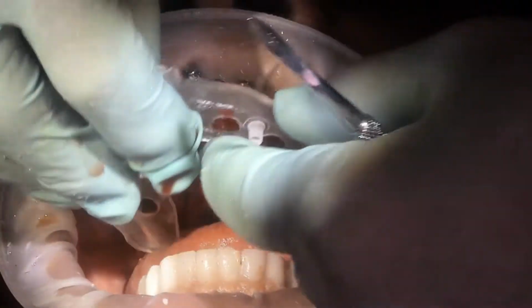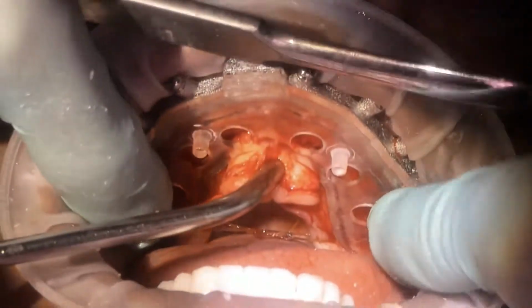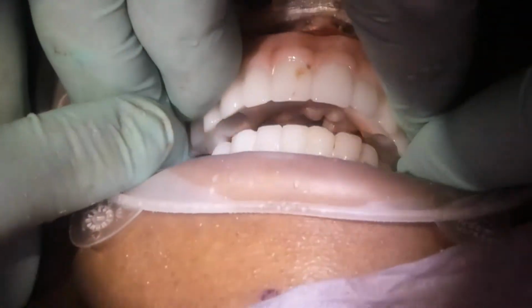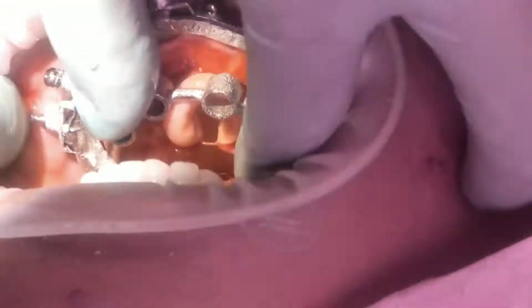Then this is a helpful trick that most of our Chrome users use, which is to place the carrier guide and make sure that it seats and clips in gingerly. If it does, then you can place the prosthetic on and check occlusion in a single arch case. In a double arch case you can't really, because the opposing will be new teeth. In this case, they happen to just come together.